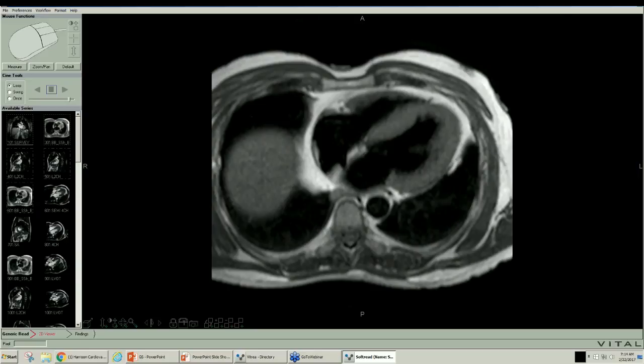So now we've fixed the location of liver, spleen, and heart, we can go on to the next part of our study, which is usually the black blood study. So obviously the blood is black. And so we're looking at hypertrophy of the left ventricle and thickness. So let's see if we can measure that. So we'll come over here and we'll measure across here. And we get 19.9, so it's 20. And then we can come here. Here's the papillary muscle. Here would be the papillary muscle cord junction. So if we drop sort of a perpendicular here, if we had a tangent, we'll get 19.4.